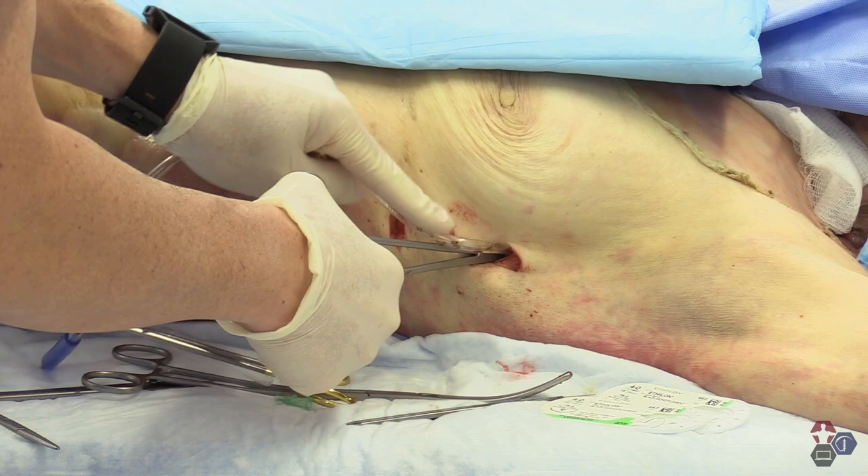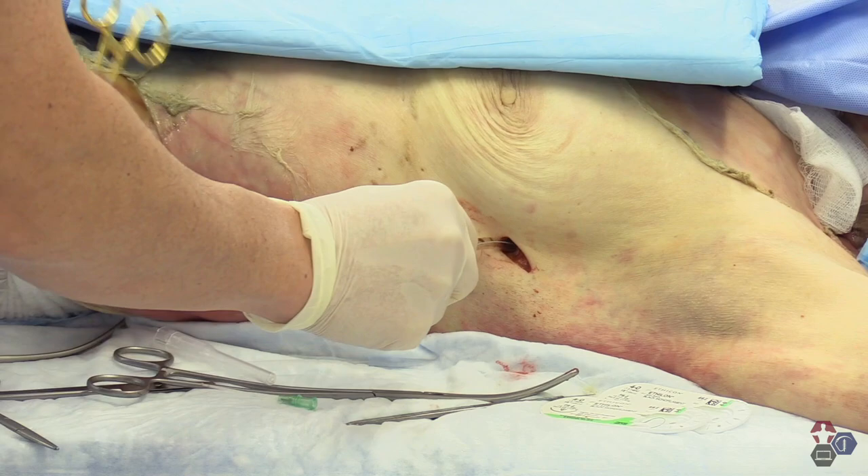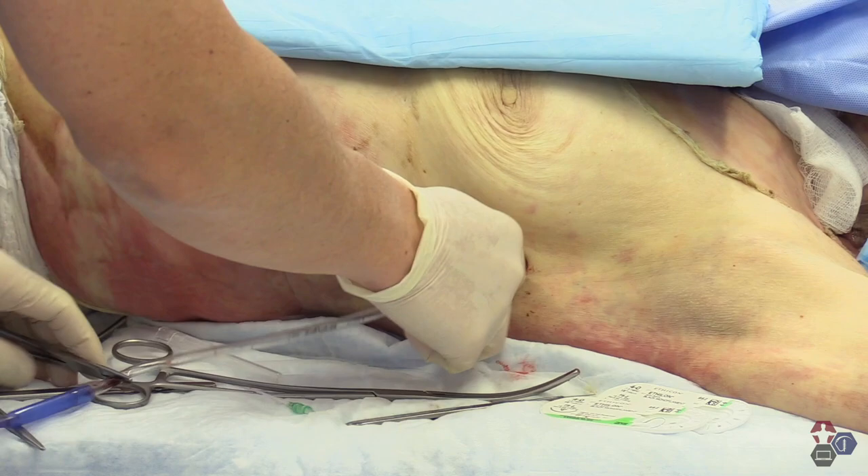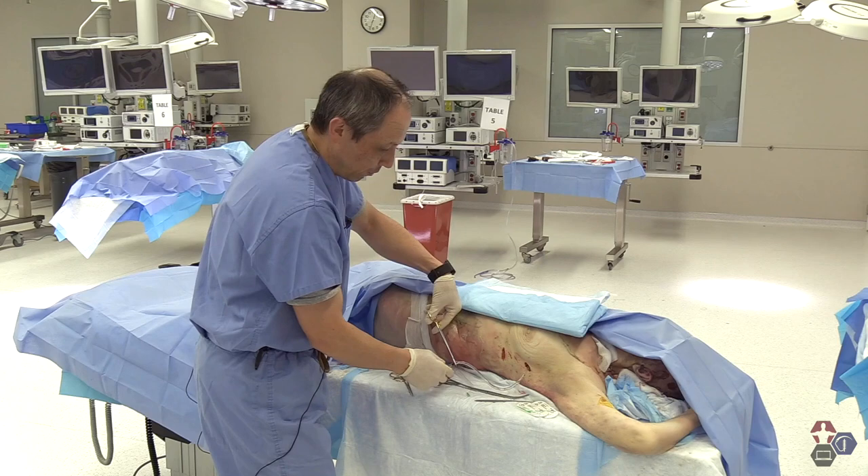From here, slide the chest tube in, release the Kelly clamp, and the tip here is to do a rotation of the chest tube, allowing it to slowly go in to avoid any sort of kinking. Once the chest tube is in place, you can release the clamp distally and attach to the Pleurevac with the help of an assistant.